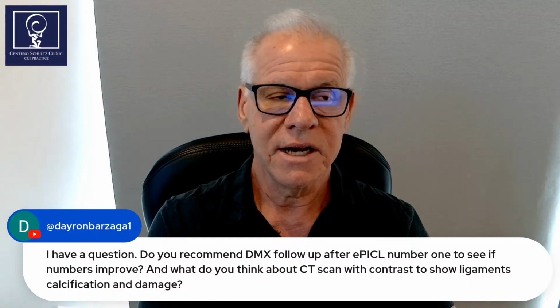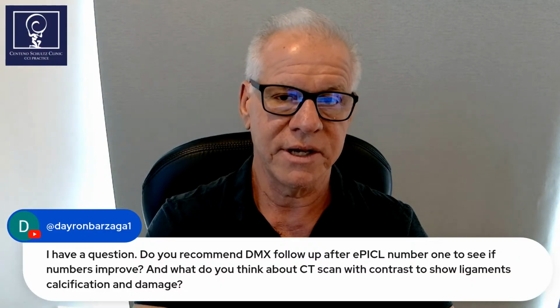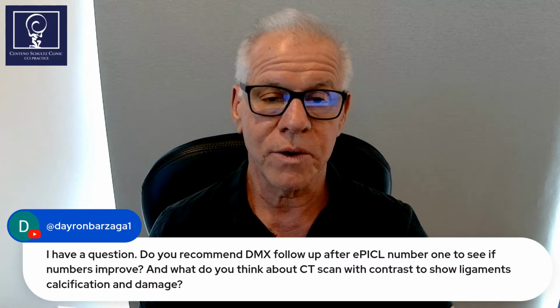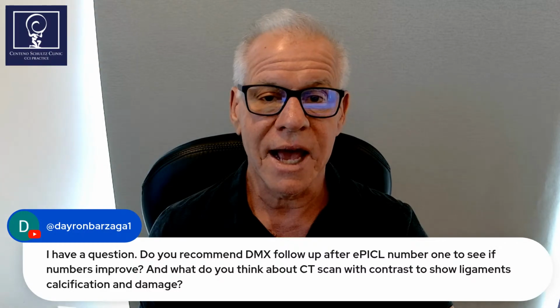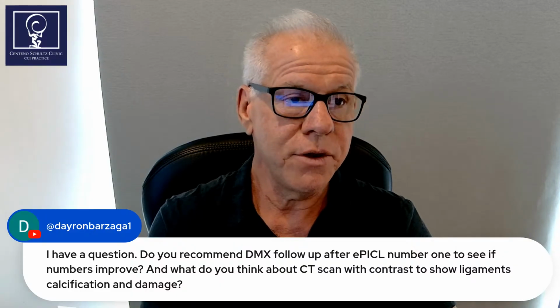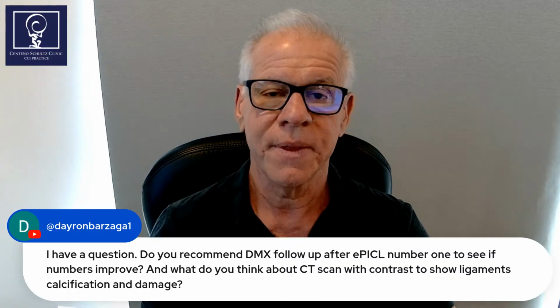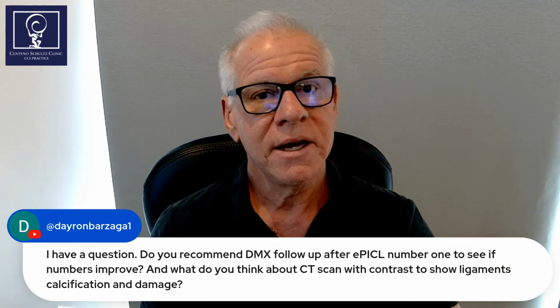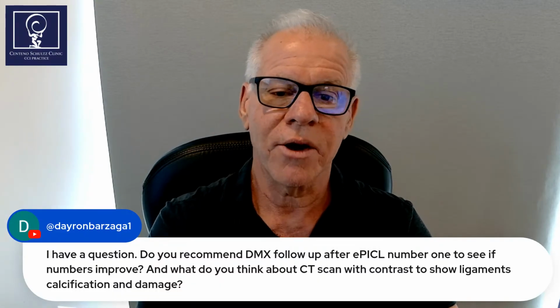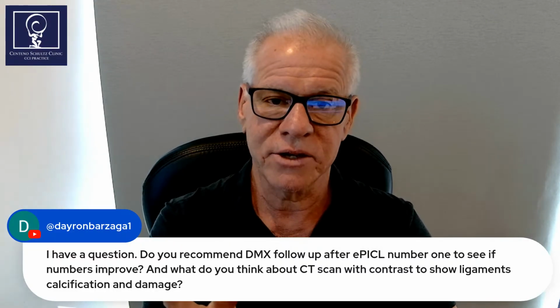Having said that, I have a lot of patients that are concerned about X-ray exposure, so I generally don't do it unless there's a specific reason to do it. But we can do it at any time. So just realize that, yes, we can go in and repeat that and see how things have changed. But if you ask me, I would probably only pull the trigger on it if we had a clinical question to answer. So the clinical question might be, hey, we're not making much symptom progress, but did we make any progress with the instability? That'd be a great reason to take another look, because it helps with that decision matrix of, are we on the right path?